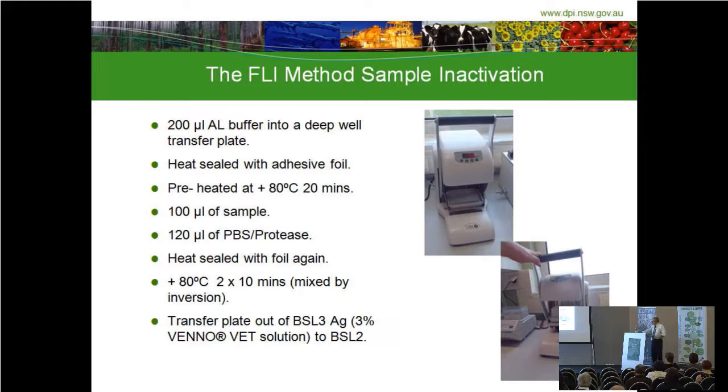Of course, what had to happen is that they had to go into lysis buffer, and these particular samples then had to be heated at 80 degrees for 20 minutes. The lysis buffer was already heated to 80 degrees. Halfway through the protocol, the plates were turned around, upside down, to make sure there was good heating. This was a fairly complex process, but nevertheless, to comply with German law, that's what we had to do. And it wasn't quite what we had in mind.